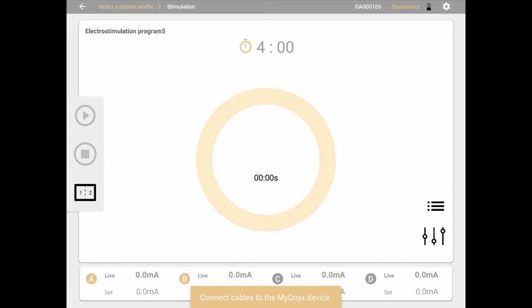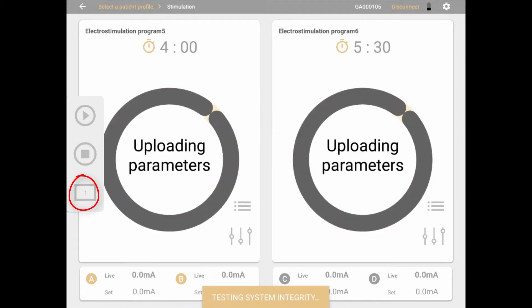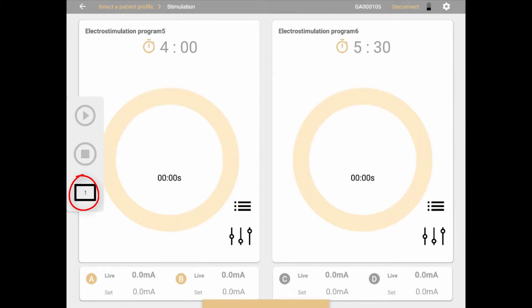The Mionics device is capable of running two separate programs simultaneously for treating two patients. To switch into dual program mode, click the split screen button on the left. The screen will be split in two and each pair of channels — AB and CD — will have separate settings and values. Click this button again to go back to single program mode.